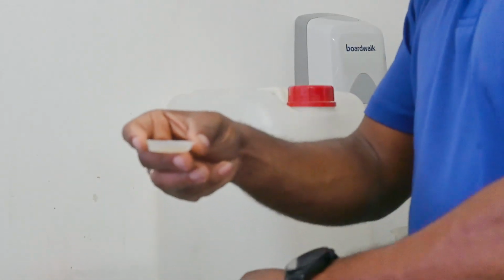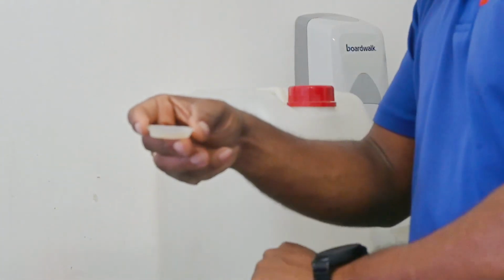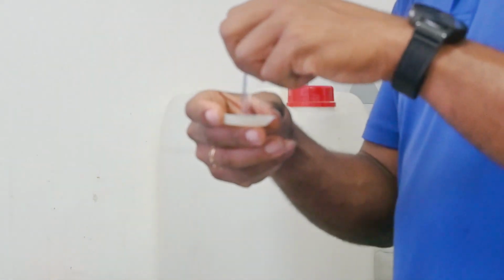If it's not fully dissolved, then you add a little bit more, stirring.